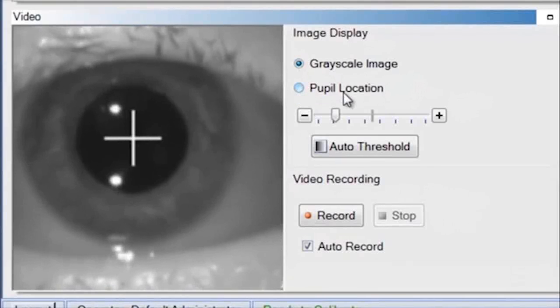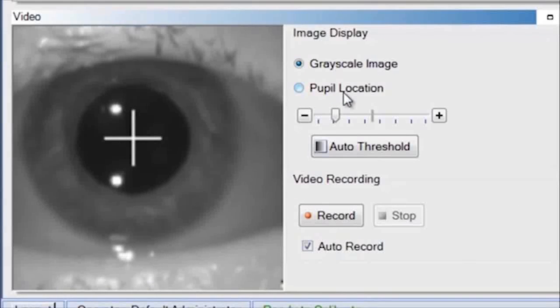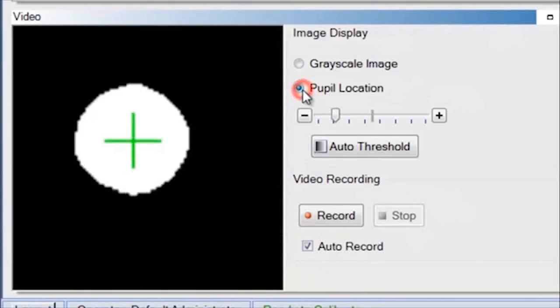If you're going to be doing a video recording, the grayscale image is what you want to use. Otherwise, I find pupil location to be more user friendly.